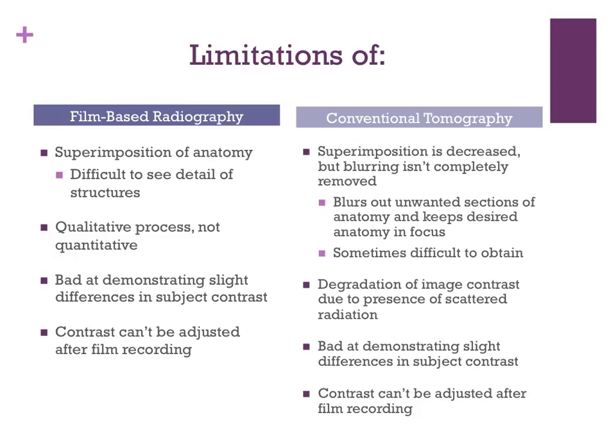Film-based radiography is also bad at demonstrating slight differences in subject contrast. And in film-based radiography, the contrast cannot be adjusted after the film recording.